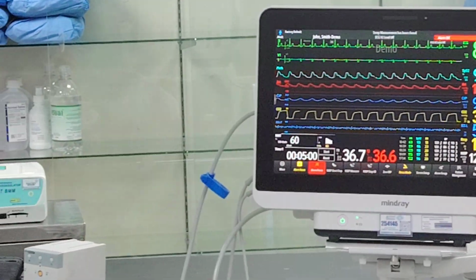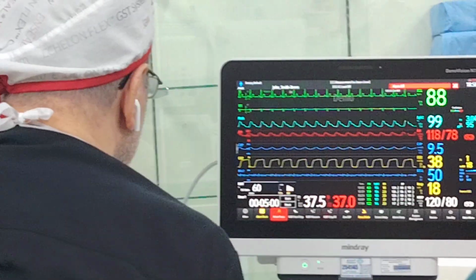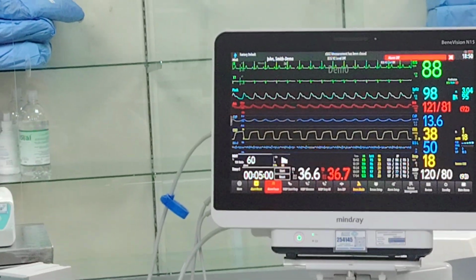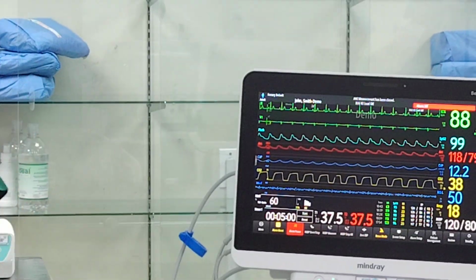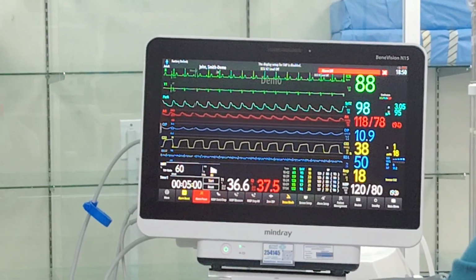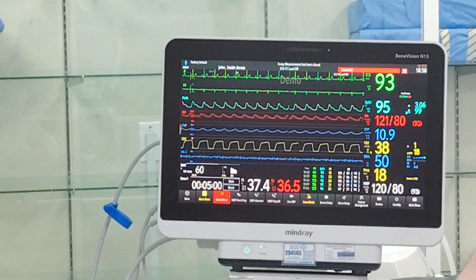Blue means you're actually no longer looking at the strength. It's how many times the machine detects it. Okay? The same thing with recovery. When you want to recover your patient, it goes upwards. So count becomes 0, 1, 2, 3, 4, meaning it can detect 4 movements. When it detects 4 movements, it will start to look at what? The strength between the 4 and the 1, which is a percentage.